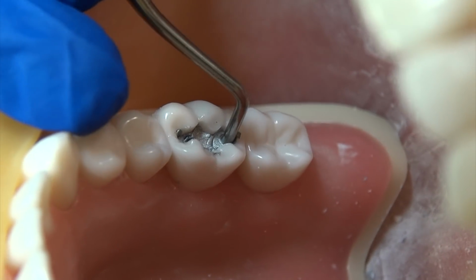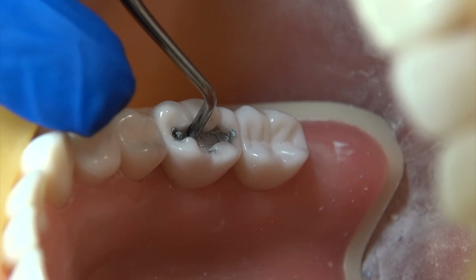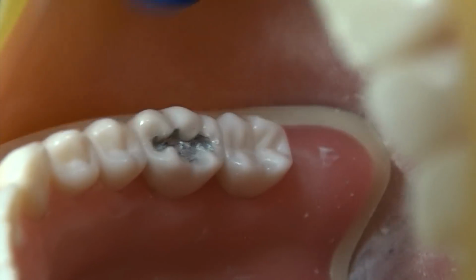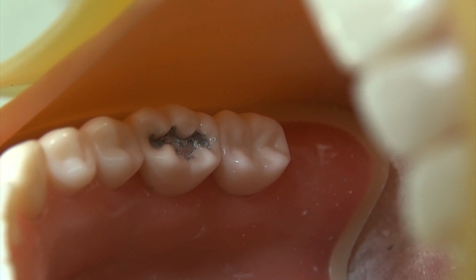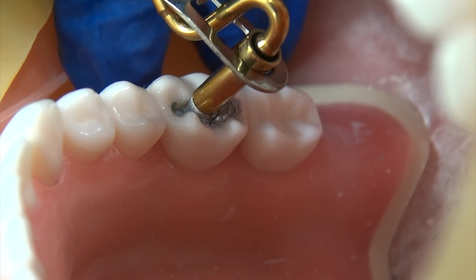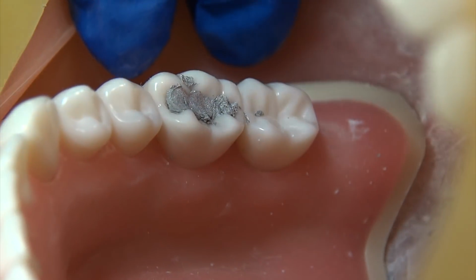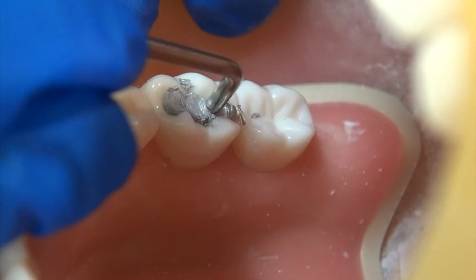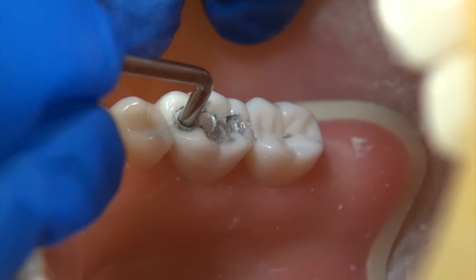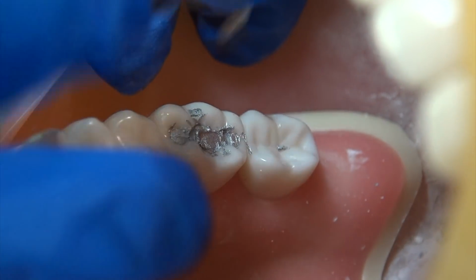Now, you want to make sure that you're doing a walking condensation. See how I'm making very small movements? Now you want to make sure that you're also using a lot of pressure. Okay, so now you're going to place your second increment, and you'll use about 3 increments. See again how I'm gliding it across. Coming back, and we're using the largest nib again to do the initial condensation. And then we're going to go to the smaller nib now.